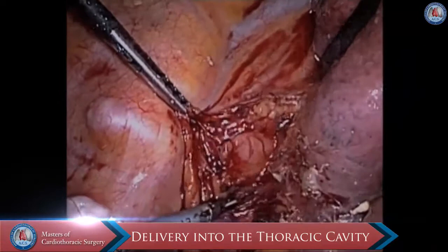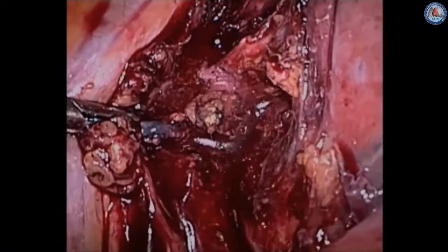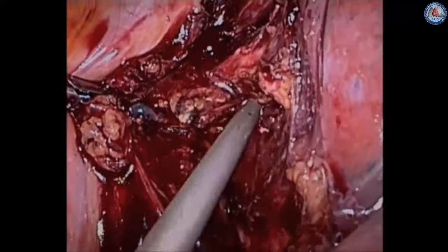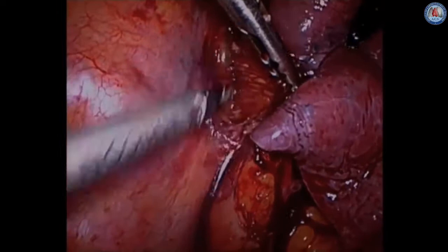Here we have the patient in the left lateral decubitus position and we're dissecting the esophagus away from the mediastinum, carefully dividing all the subcarinal nodal tissue so that it stays with the specimen. Though you can resect this separately, our preferred method is to do it en bloc. We then divide the esophagus away from the posterior mediastinum, making sure not to injure the thoracic duct.